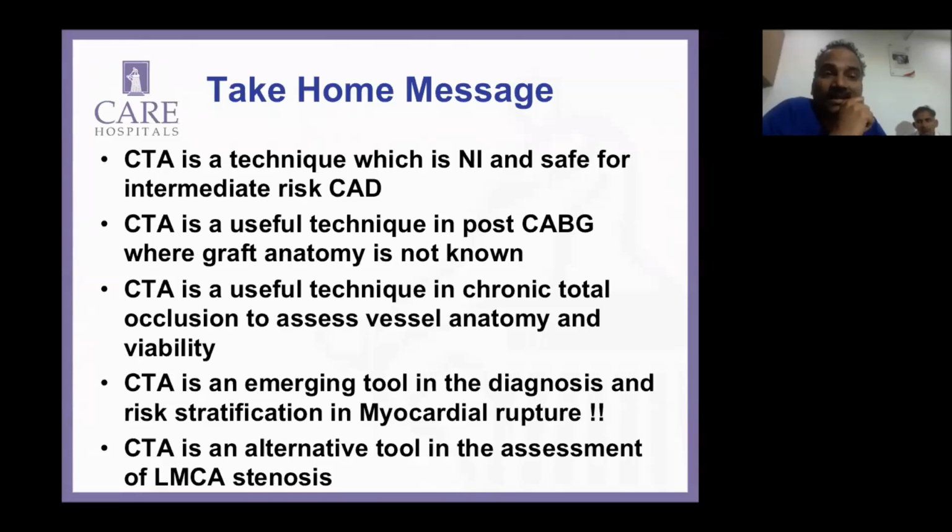See, after I started seeing my CT angiograms and analyzing them, especially in patients with chronic total occlusions, I learned a lot. In fact, now I'm even deciding where I have to go ahead with rotablation. I can also say beforehand which wire will work in this patient.